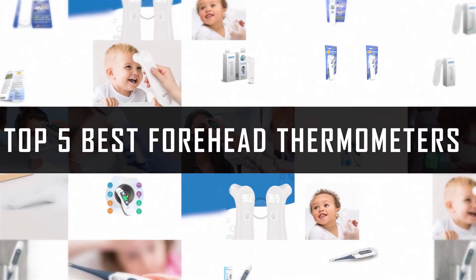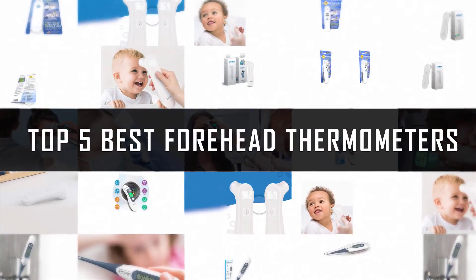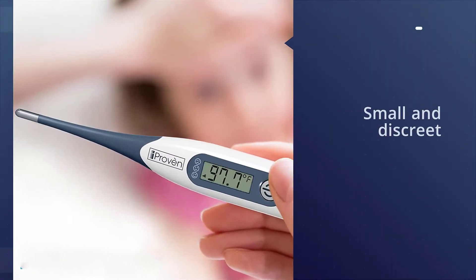If you are looking for the best forehead thermometer, here is a collection you have got to see. Let's get started. Number one, most popular: the iProven DTR-1221 AWG thermometer.